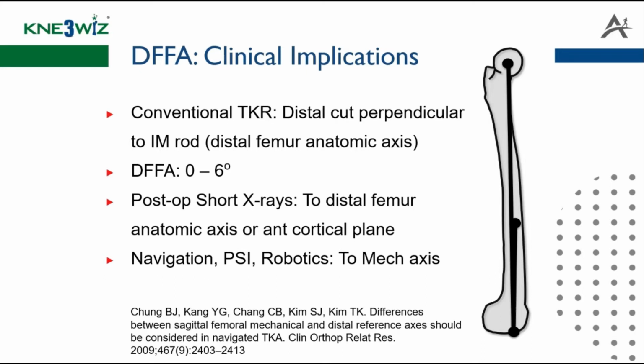Digital tools in total knee replacement usually follow only the mechanical axis. Thus, technology like computer navigation or imageless robotics will place the component in greater extension compared to conventional. Also, if the surgeon is blinded to the intramedullary axis, the surgeon places the component in an approximate guesswork flexion or extension, even with technologies like robotics.